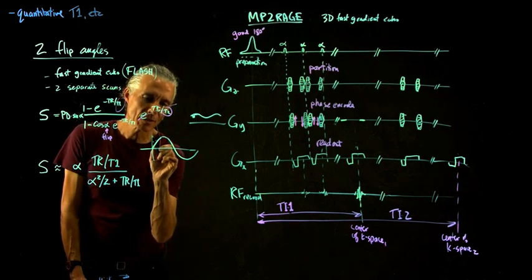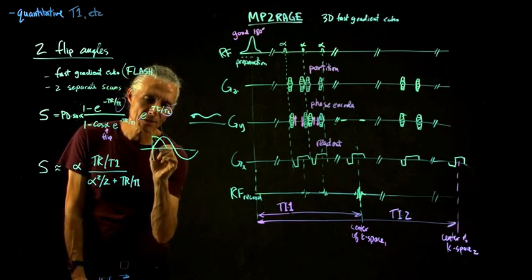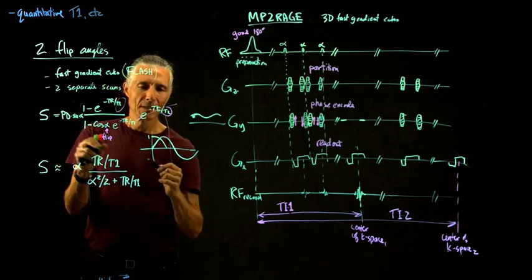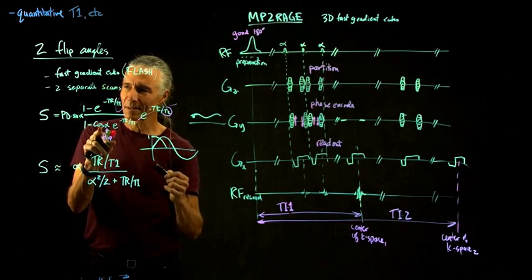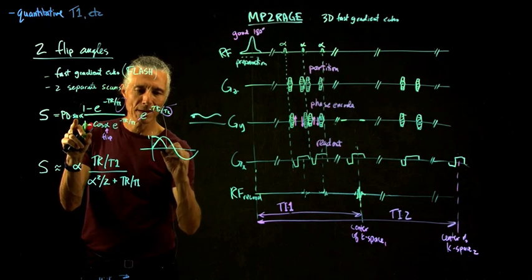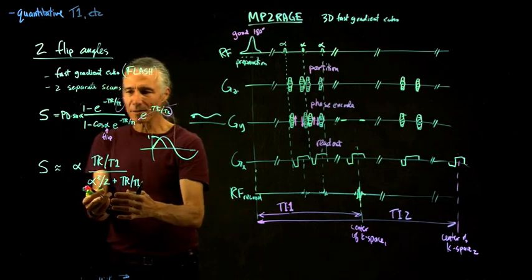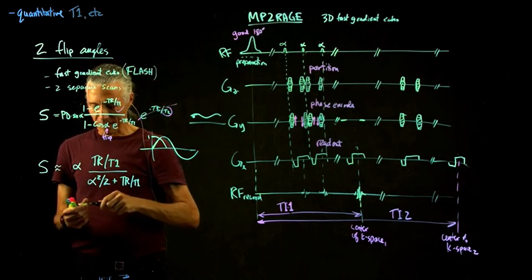And a cosine also starts off, if your flip angle is low, as not any different than 1. So you can throw out this cosine, and the sine can be approximated by just the slope of a line. So this one is a linear equation without all the exponentials in it.